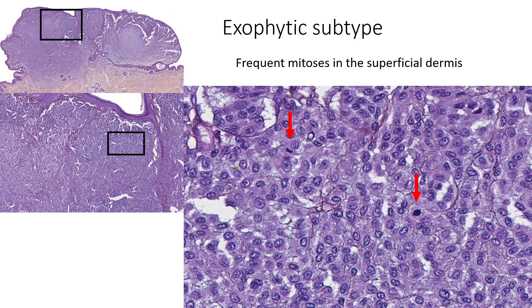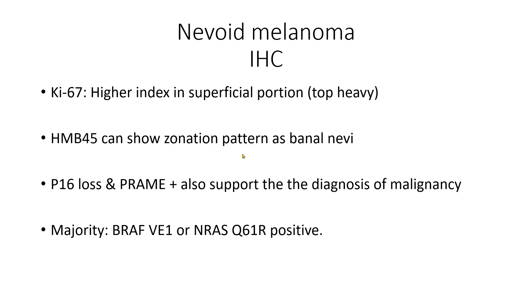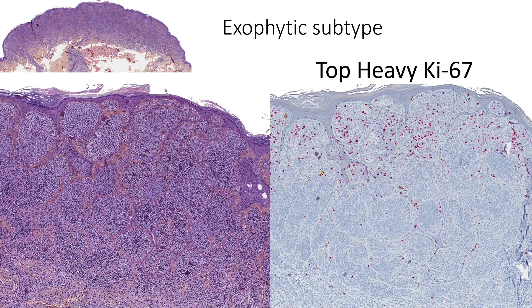Mitotic activity is often frequently found in the superficial dermis. The proliferation marker will often show a top-heavy distribution that matches the presence of mitotic figures in the upper dermis.